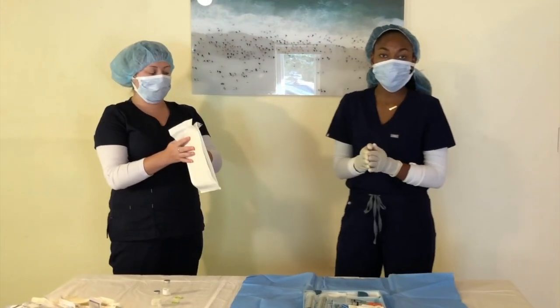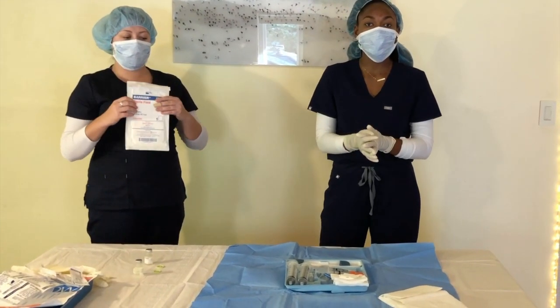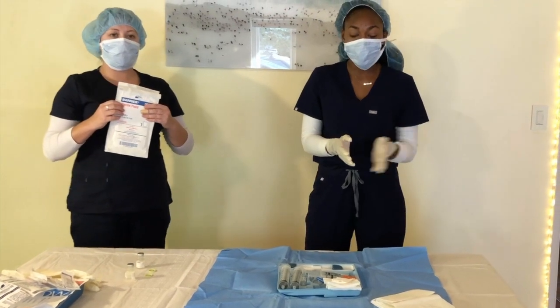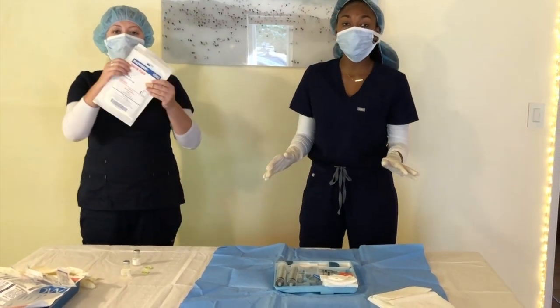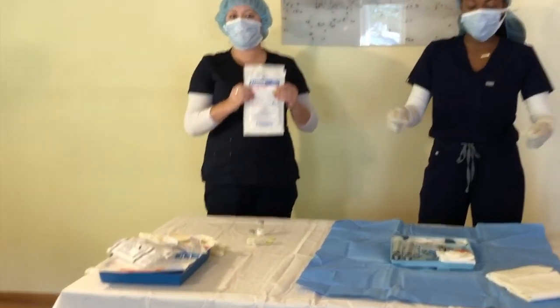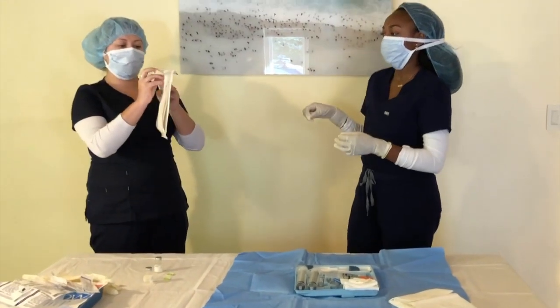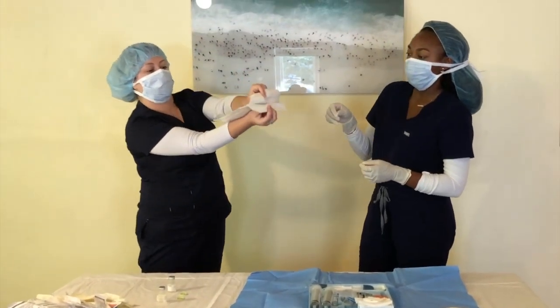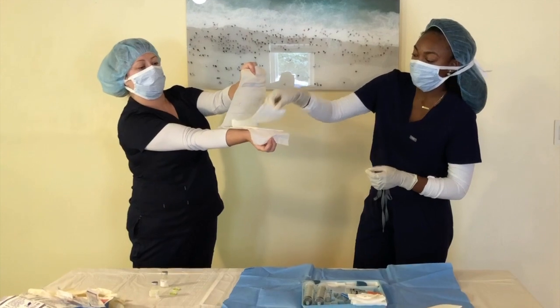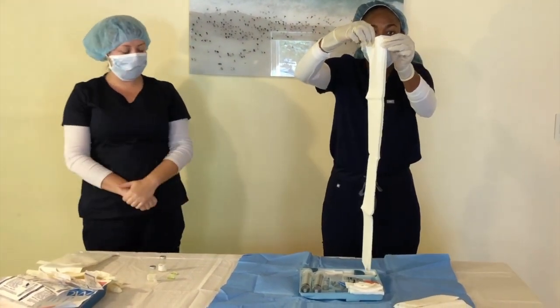Now that we're ready to call the radiologist to come down and do this fluoro procedure, because we have our patient changing, we're going to cover our sterile field. We never want to leave it unattended or even leave it at all without a cover once it's done being set up. So Tegan is going to open it for me, and I'm going to pull it from the outside. Perfect, she's opening it away. I'm going to grab it. Thank you, Tegan.